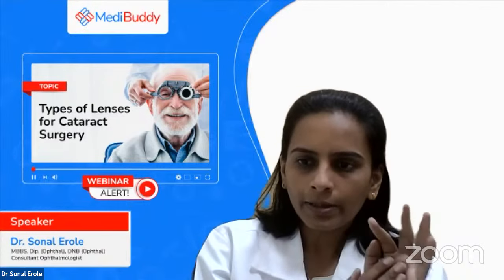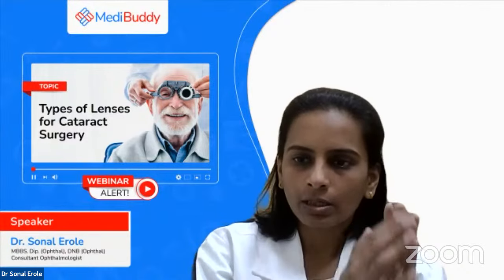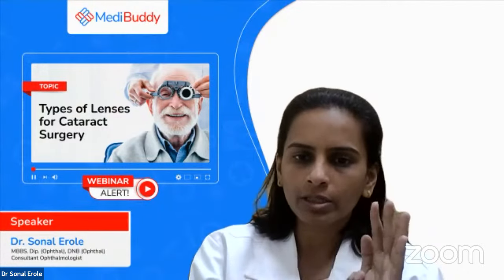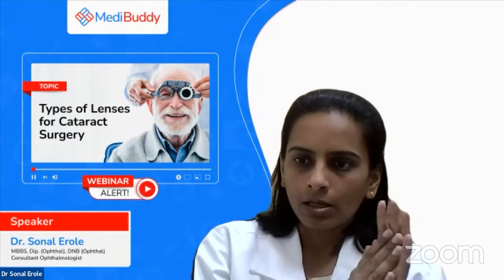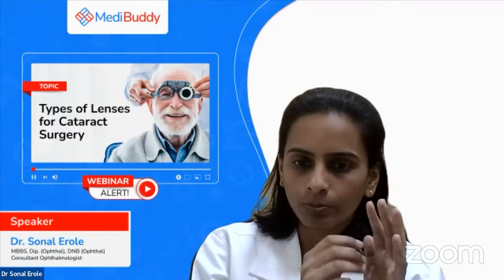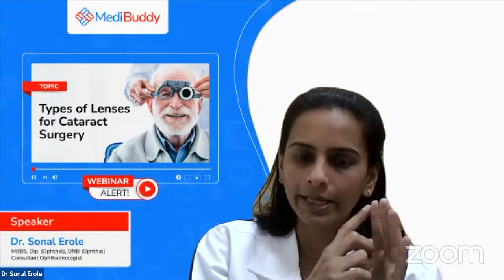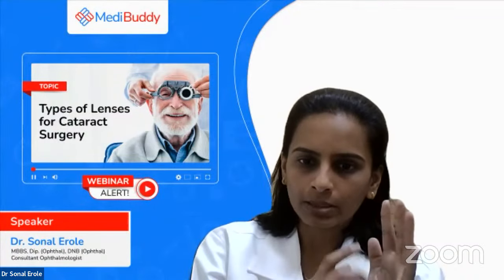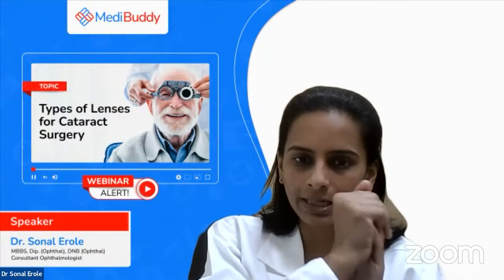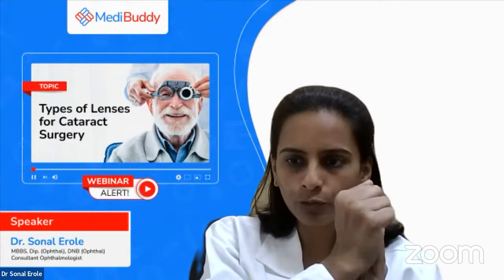So basically, whenever we are putting the lenses for the cataract surgery, we are putting it in a bag, and we are putting it to stay for a lifetime. So very few times we may need to remove that lens. But at that time, the bag in which we are putting the lens can get compromised, because once we have put the lens, there can be strong adhesions with the lens in our body. So we say that this lens becomes a part of your body.